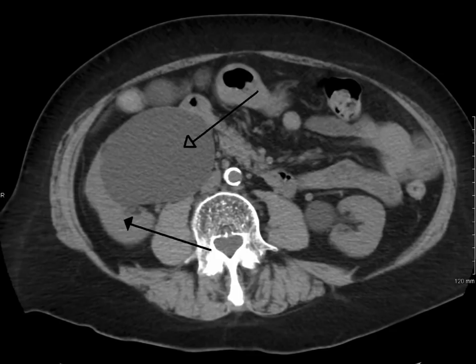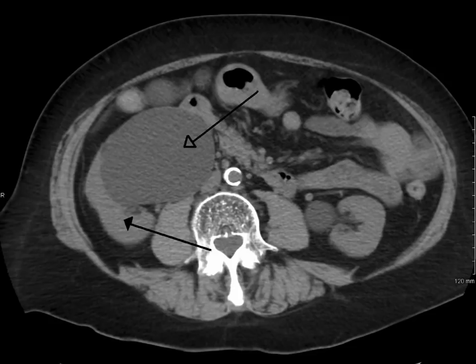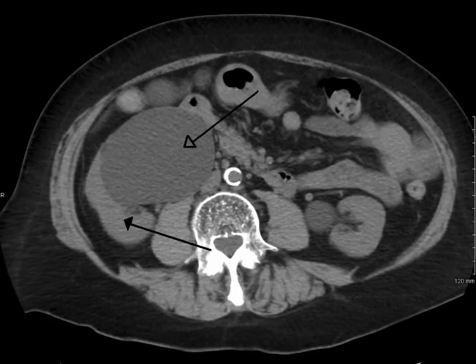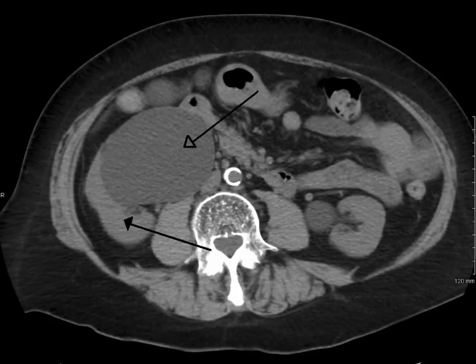What do we see here? Pause the video if you need more time. What we're seeing here is a huge fluid-filled cavity within the kidney, suggestive of hydronephrosis. The arrow is pointing to the large accumulation of fluid, and we know it's in the kidney because on the patient's left we see their left kidney looking relatively normal, but on the right we don't see the kidney. Fluid is filling up into the patient's right kidney — this is hydronephrosis. Both hydronephrosis and polycystic kidney disease are very high yield.